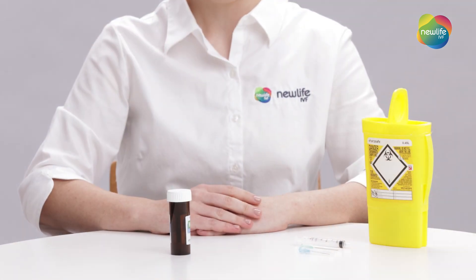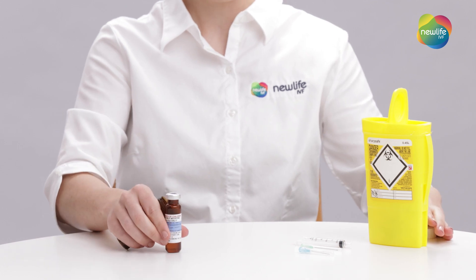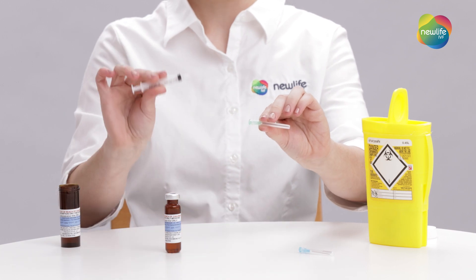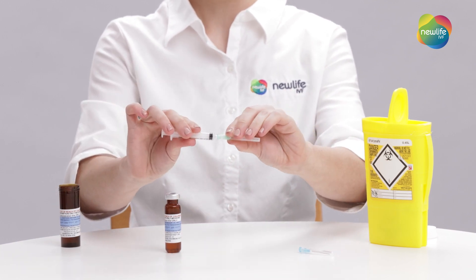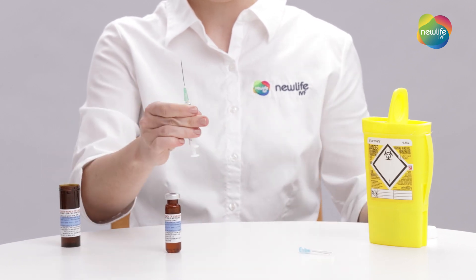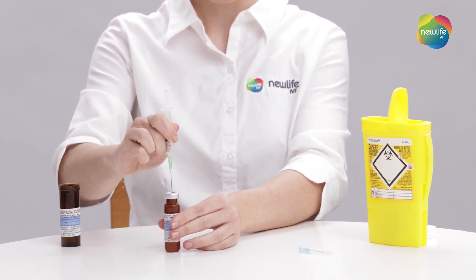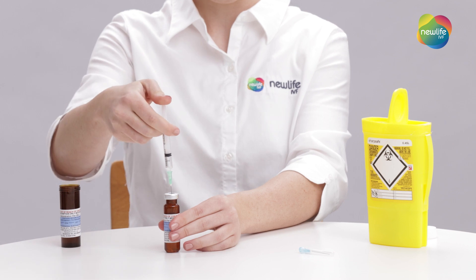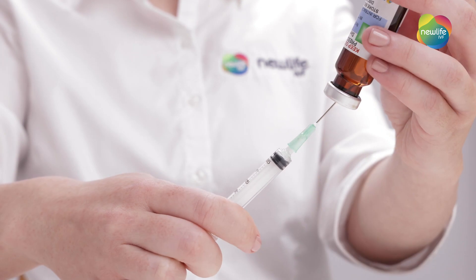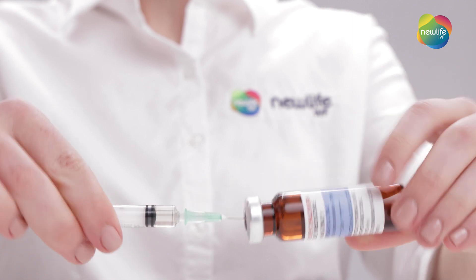Start by removing the cap from the progesterone in oil vial. Open the packaging for the 19 or 21 gauge drawing up needle and your syringe. Place the needle on the end of the syringe firmly by twisting it on. Draw one mil of air into the syringe and place the needle into your vial. Push the one mil of air into your vial, then hold the syringe up with the vial in the air. Pull down the plunger to your prescribed dose, then remove the needle from the vial.